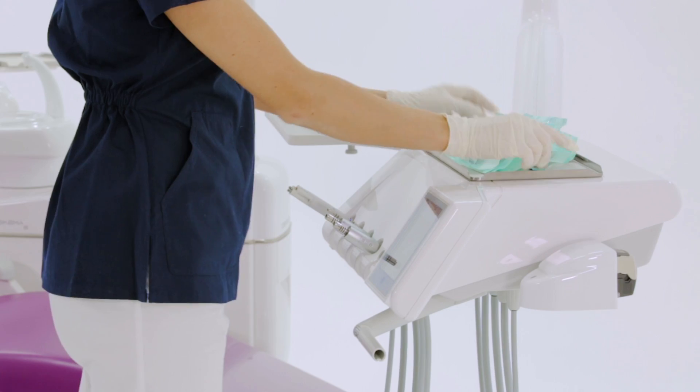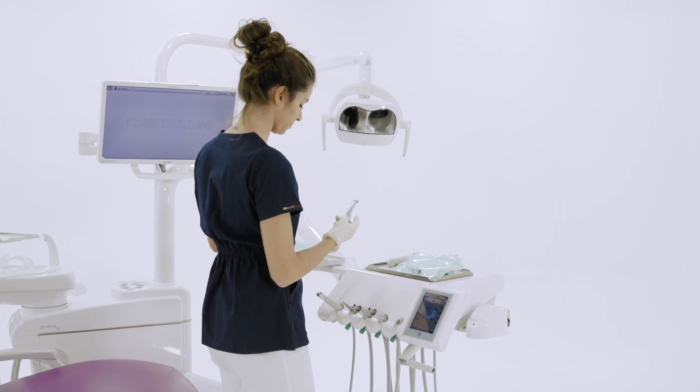The assistant lays out the sterilized material in preparation for the next patient.